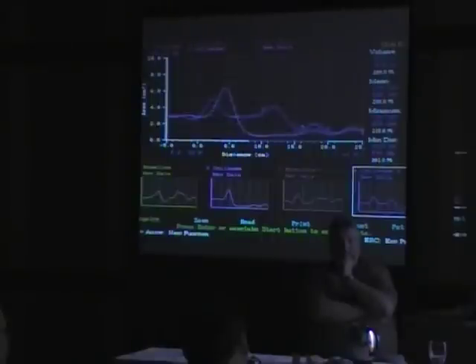Because one of the oldsters from the Academy of Dental Sleep Medicine said this equipment had no value, but if your appliance isn't working, just increase the vertical dimension. Okay, how much? How far? Well, just do it. There are no guides. With this, at the second and third follow-up appointment, we schedule half an hour with one of my assistants who will use the shims and check different vertical changes in the appliance to see if we can maximize those numbers. Is it a golden position? No, but it is a trend.